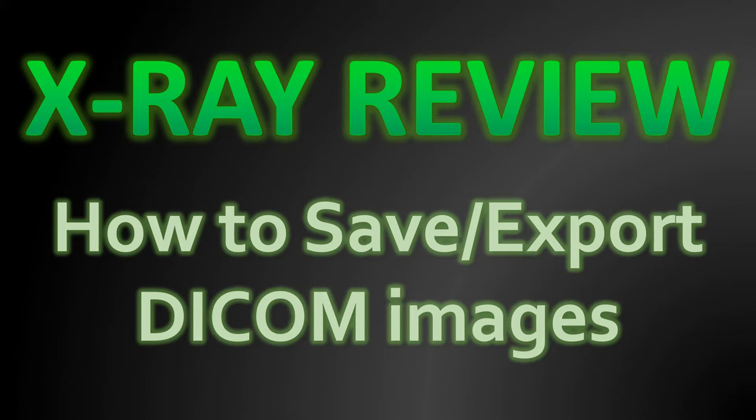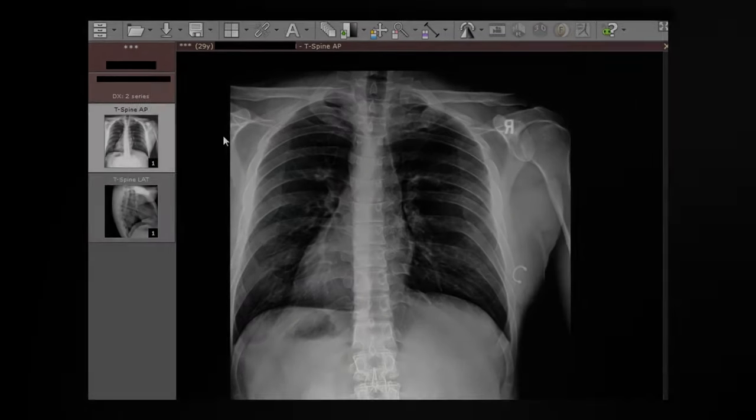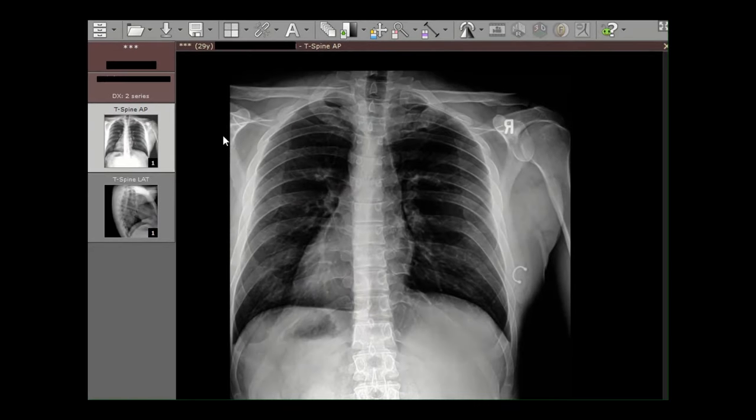Welcome to x-ray review. This will be a quick video about how to save and export DICOM images.